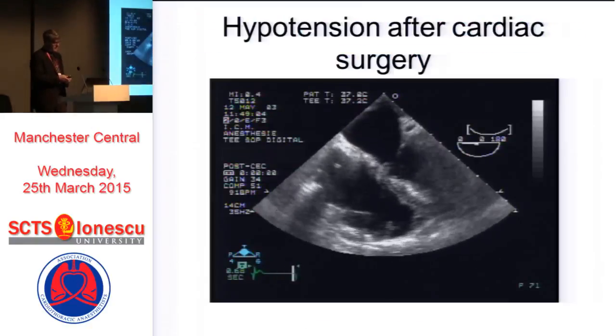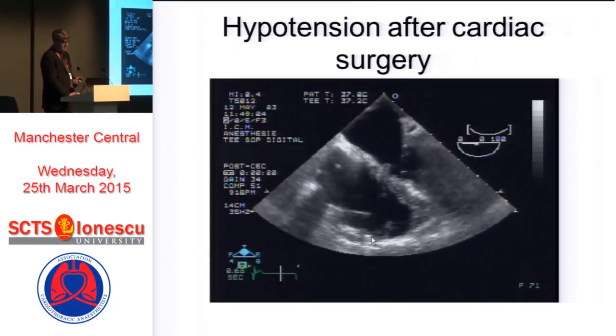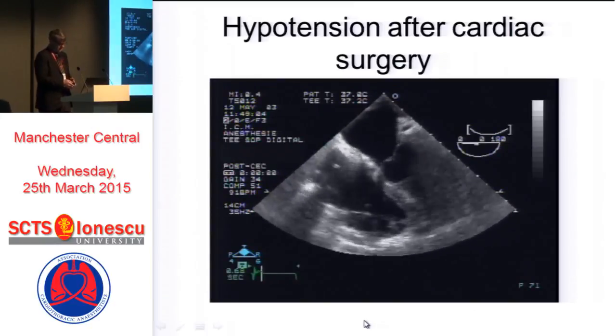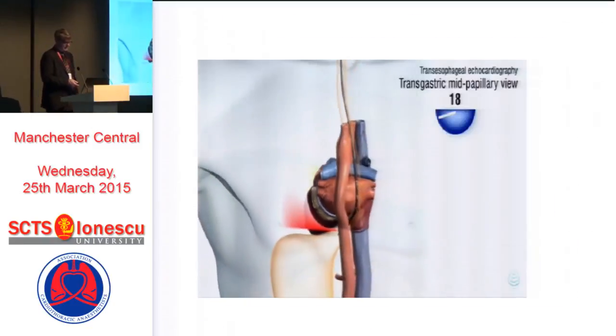So this is an example of a patient who has severe right ventricular dysfunction. You can see here the absence of any tricuspid annular motion, and you can rapidly appreciate, even without measurement, that the fractional area change is definitively below 35%.